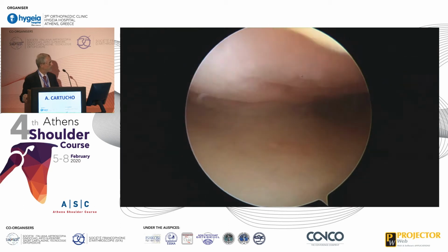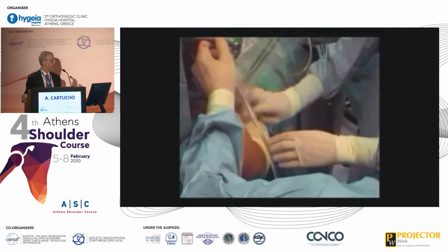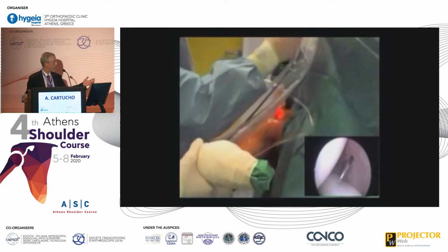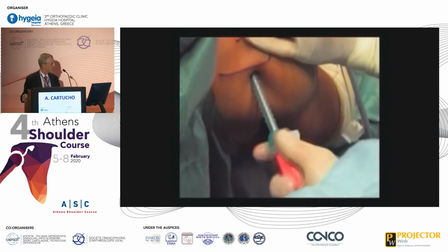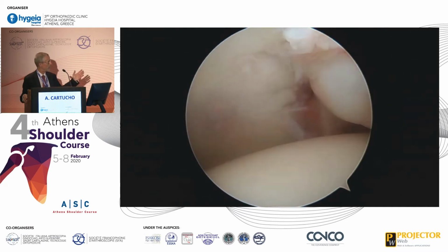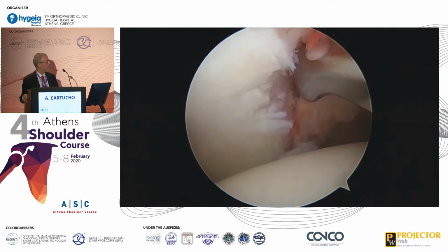One of the things that I do is that I work from an anterior view. I don't look at my shoulder from the posterior view when I want to do this. So I work like that with two portals, and I search my posterior labrum, and I also use a posterior cannula in order to make it easier for me. So this is my anterior view. I'm looking from the anterior superior portal and working from the anterior inferior portal.